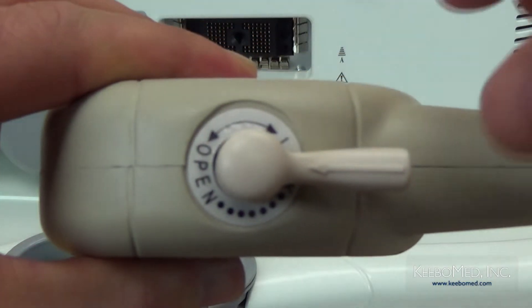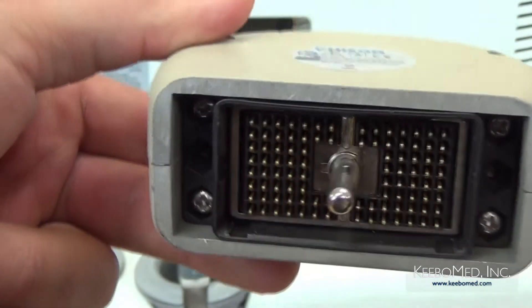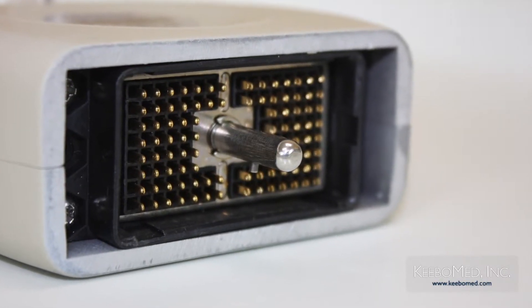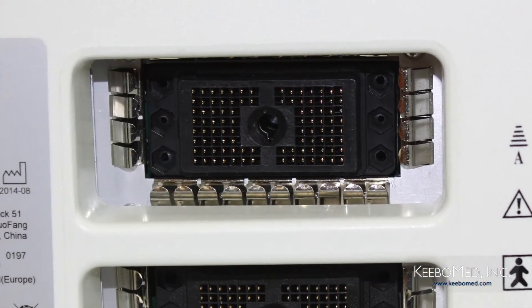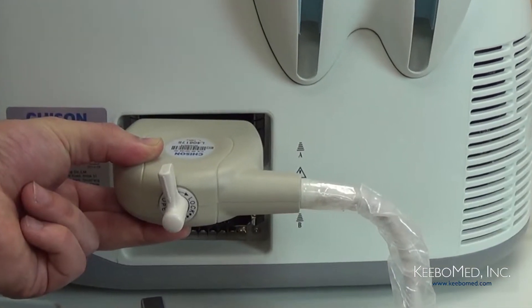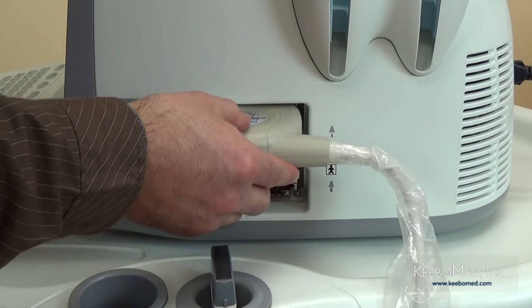Step 3, put the probe lock knob to open status and make sure that the small tongue of the probe lock inside the probe connector is at the same position of the slot on the probe socket. Step 4, make sure that the probe cord is facing toward the back of the machine and horizontally insert the probe connector into the probe socket.